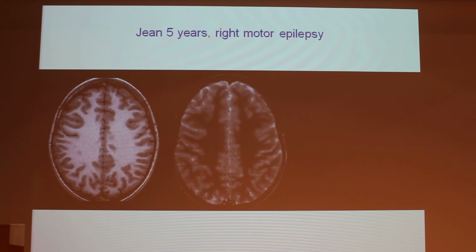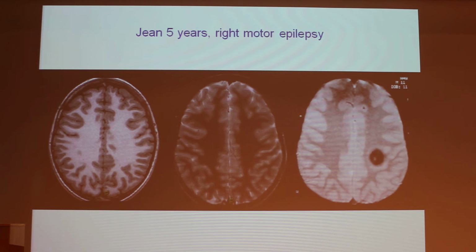You don't perform contrast injection. T2 star, Laurence. Yes, it was a cavernoma. It is very important to have T2 star, take home message, T2 star. It is very important if it is a normal MRI in intractable epilepsy, because in children it is not calcified.